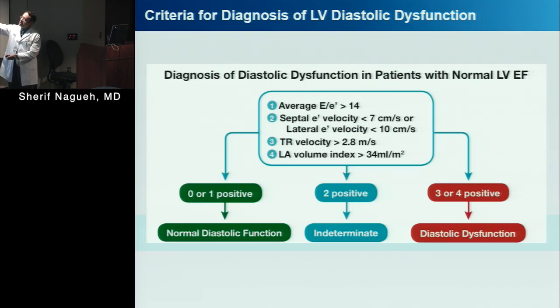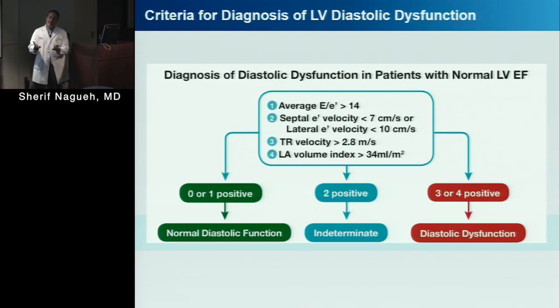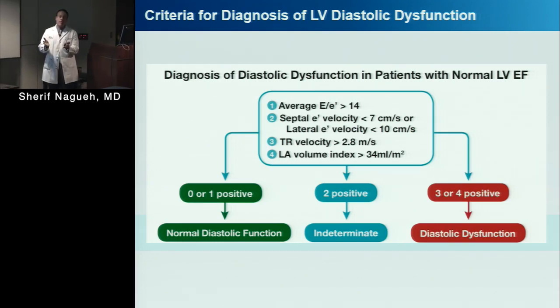Okay, these should be applied in patients where you're looking at their clinical data and their echocardiogram, and you do not have any history of clinical disease. You are not seeing LVH. There is nothing there, or coronary disease. In that setting, then we go to these criteria.